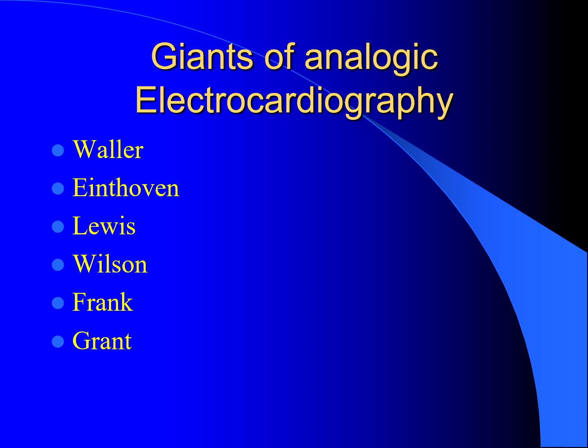Today, the progress of the technique has allowed the digitization and storage of data, its recovery, and the possibility of carrying out different manipulations and measurements on them, even in cases stored in databases.